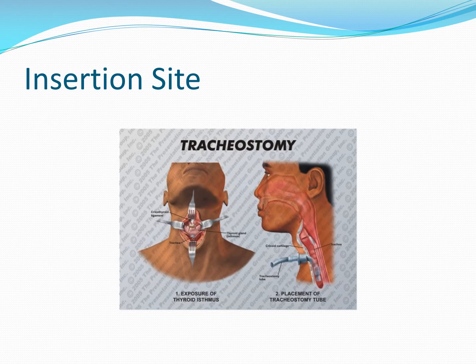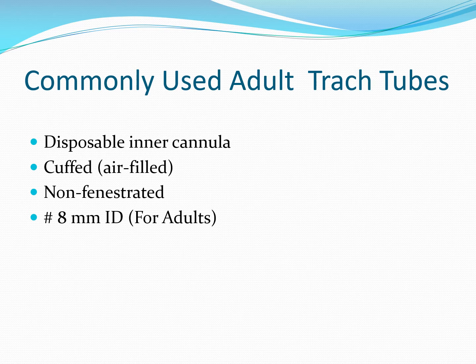Any bleeding can be minimized. It's usually a cauterizing electric scalpel that's used, so it both cuts and cauterizes at the same time. And you can see the front to back shot on the left-hand side, as well as the right-hand side showing the lateral depiction of once the tube is in place, where it's located both on the outside as well as in the trachea itself.